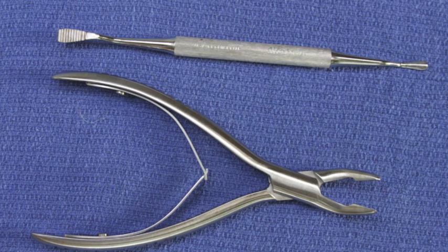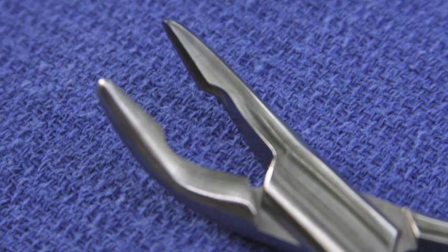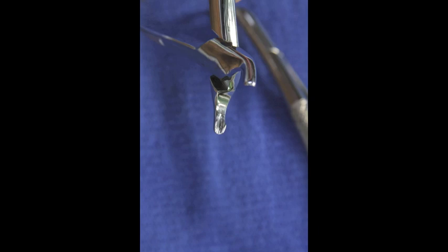When looking at the rongeur's beaks, one of the things to notice right away is that there is a scooped out portion in the center, and that when the beaks are closed, you'll notice that the edges come into tight contact with one another, and the edges themselves have a sharp edge. It's not razor sharp, but it is sharp. This is in distinct contrast to a forceps that is used for extraction of teeth, where they have a scooped out edge as well, but their edges are not sharp.